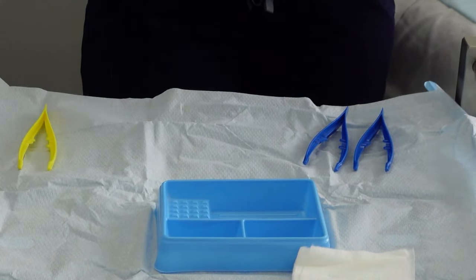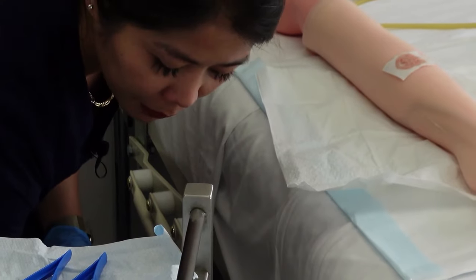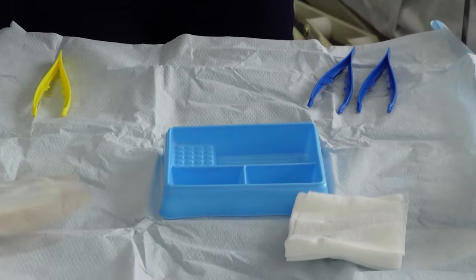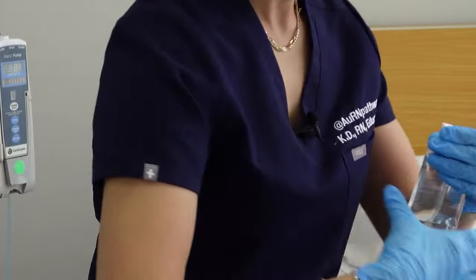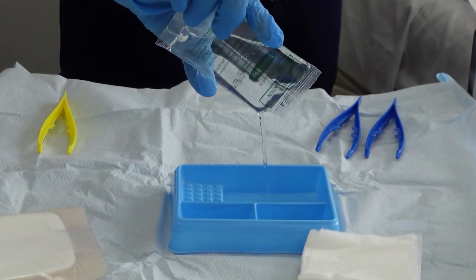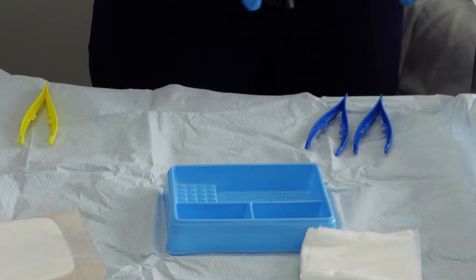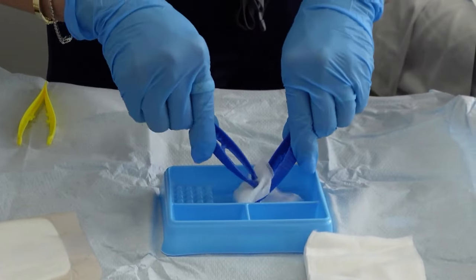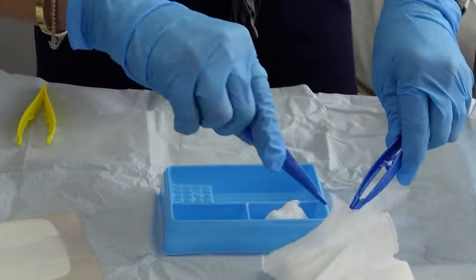I'll be placing this close to the wound, and I'm going to grab the drape to put underneath the patient's wound. Then I'll grab the rest of my equipment and open the dressing pack carefully. When pouring your water for irrigation, pour it a few centimeters away from your sterile field. The yellow tong will remain as your extra tong, and we'll be using these two tongs to clean the wound.